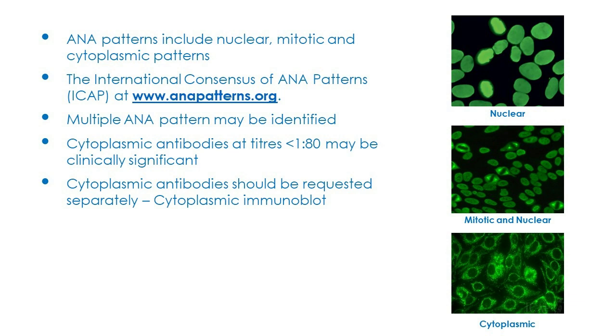At AMPATH, we report the nuclear and mitotic patterns and report the presence of cytoplasmic antibodies without further characterization. It is important to note that funders in South Africa do not recognize cytoplasmic antibodies as part of the ANA test, and this should be requested separately.